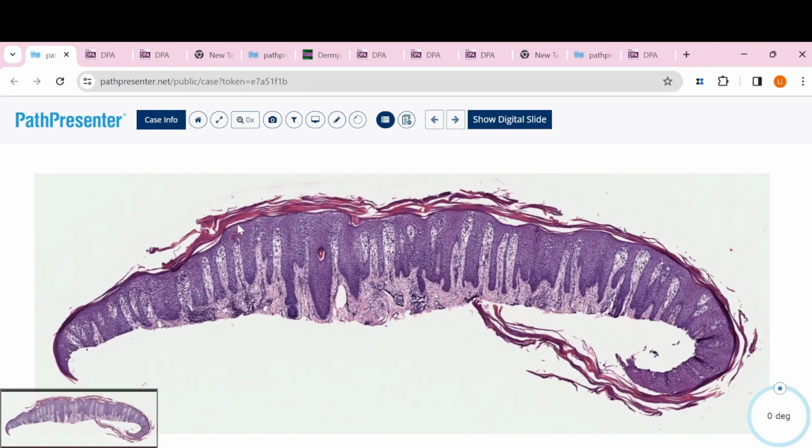That is the hypogranulosis. Then we usually do not see spongiotic dermatitis, but if the patient feels itching and scratches, you will see that like here, just a little bit. But the spongiosis would not be your main thinking in psoriasis. Then we have this regular elongation of the rete ridges. Regular means we have the same level of all the rete ridges like here. That is regular for psoriasis.